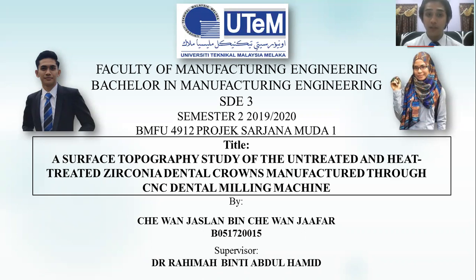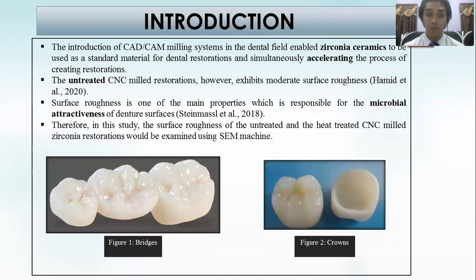So my title for my bachelor's degree project is a surface topography study of the untreated and heat-treated zirconia dental crowns manufactured through CNC dental milling machines. The introduction of CAD/CAM milling systems in the dental field enables zirconia ceramics to be used as a standard material for dental restorations and simultaneously accelerating the process of creating the restorations.